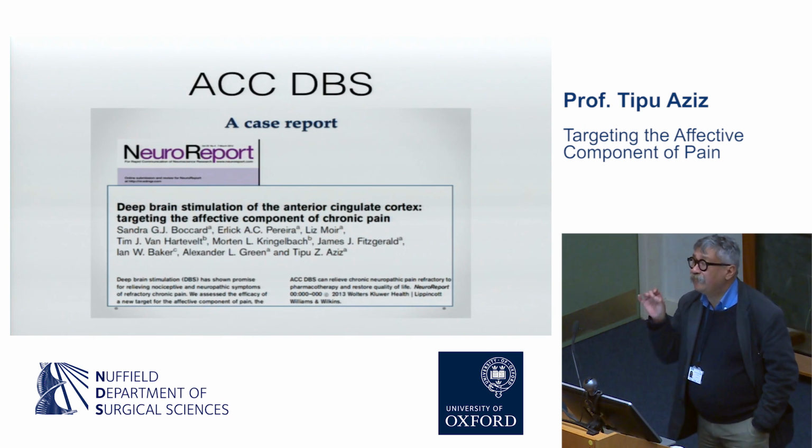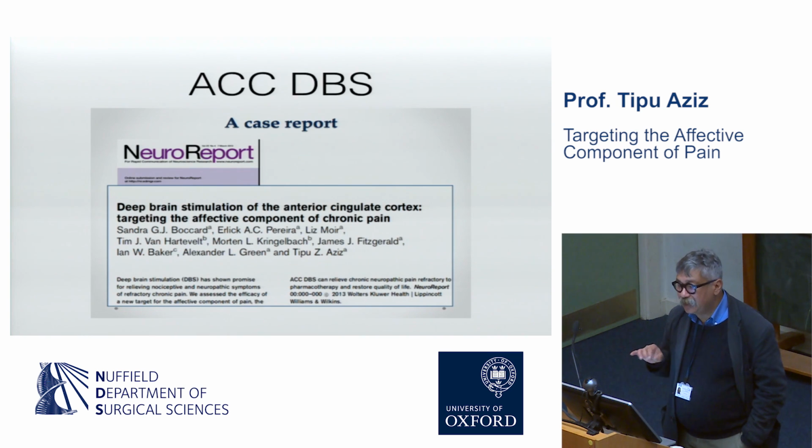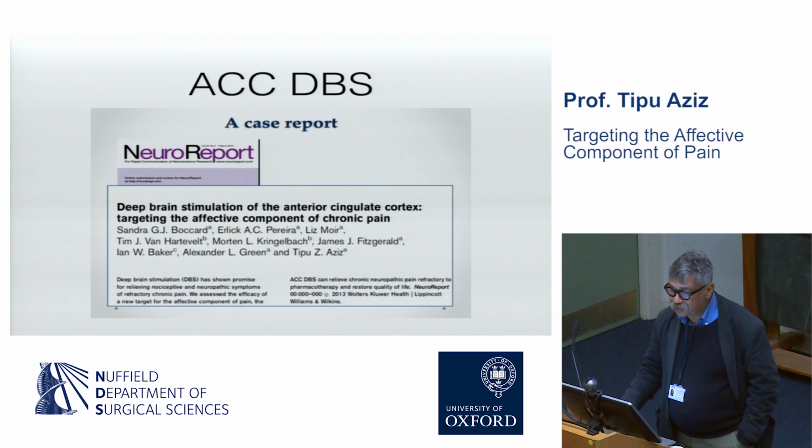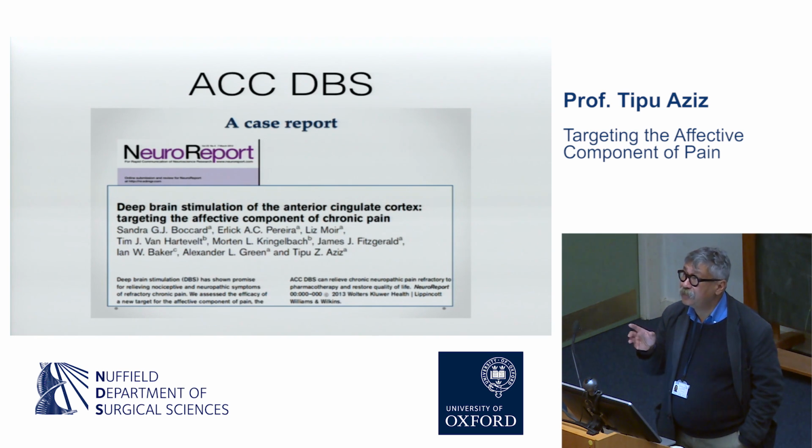So, if lesional surgery could be so effective, could we use the same target as we did in movement disorders, transfer the conclusions of lesions to that of deep brain stimulation? Because we still have a huge population of patients with intractable neuropathic pain syndromes. And this was the first detailed case report of deep brain stimulation of the anterior cingulate cortex. There was a case prior to this which was with poor imaging and poor outcome quality in that single case, we were unable to interpret usefully. And in this case, the pain relief was so dramatic, we went on to start our series on the same basis of functional surgery, transferring the concept of lesional procedures with deep brain stimulation.